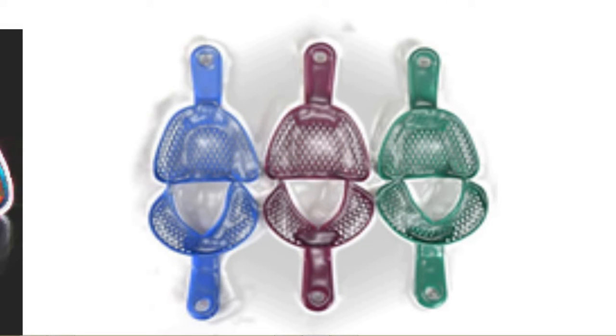So, coming on to the disinfection of impression trays. Impression trays can be rinsed thoroughly under running water to remove residual blood and saliva. Pre-cleaning removes additional bioburden and any adherent impression materials. Consistent with dental infection control, these are semi-critical instruments. Chrome-plated and aluminium impression trays can be cleaned, packaged and heat sterilized. Single-use plastic impression trays provide a disposable alternative to heat sterilization.